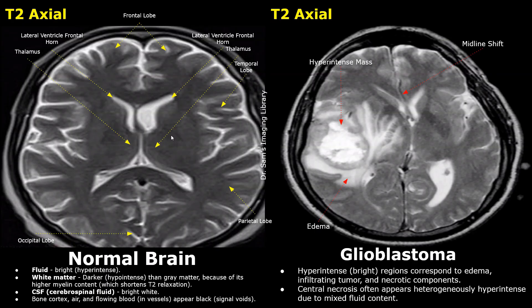The cerebrospinal fluid appears bright white. The bone cortex, air, and flowing blood in vessels appear black.